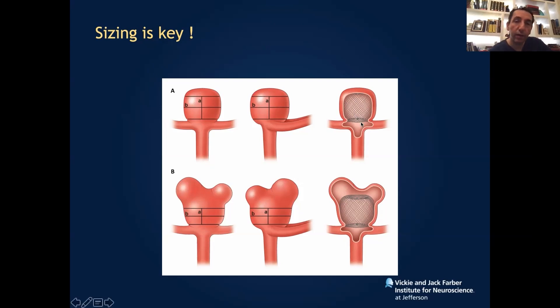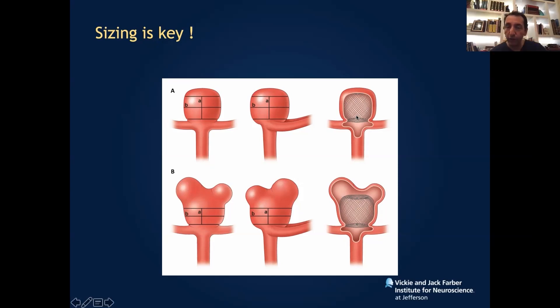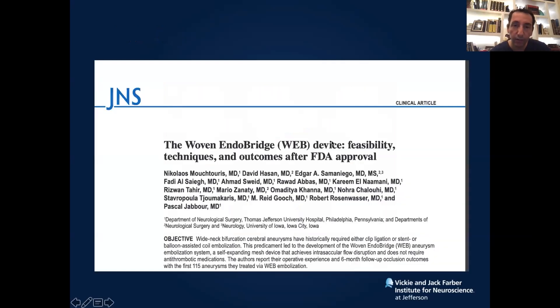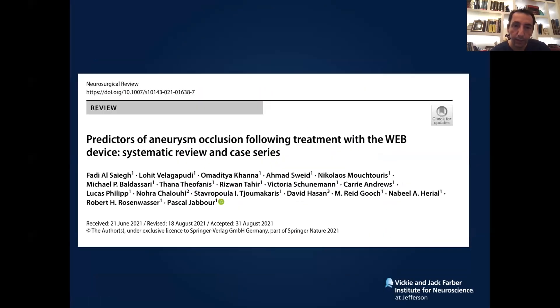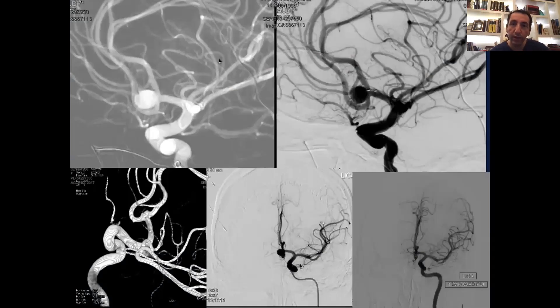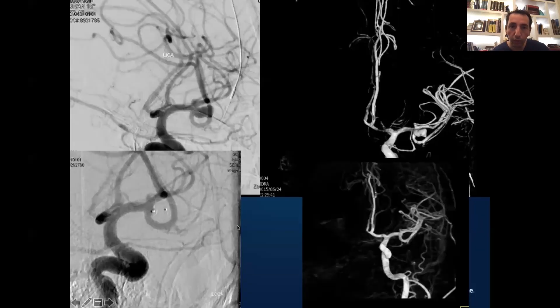This is from our paper about the WEB device, showing some techniques. You need to oversize the WEB to make sure that you're plugging the aneurysm. Those are some predictors of WEB occlusion. Here you see the WEB device before and after — complete occlusion.